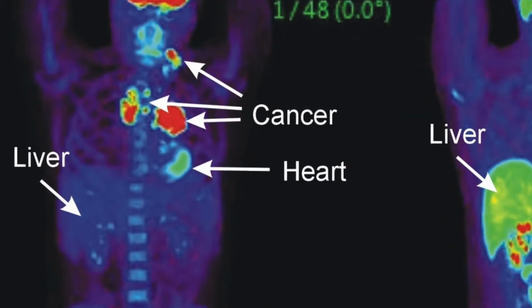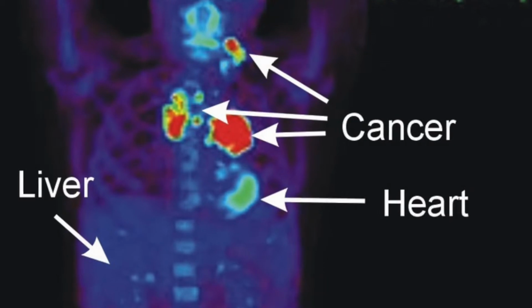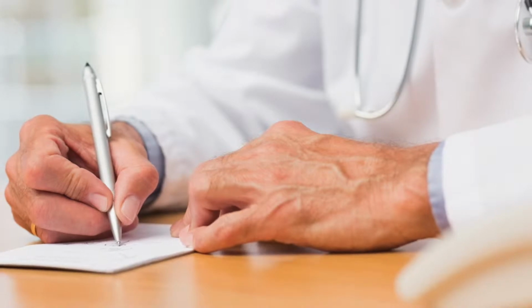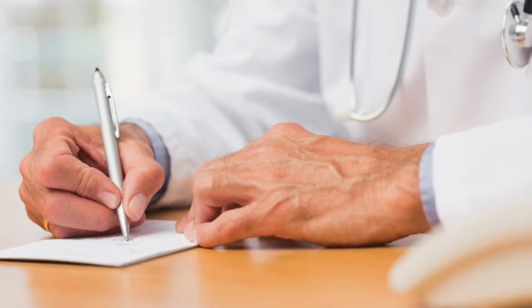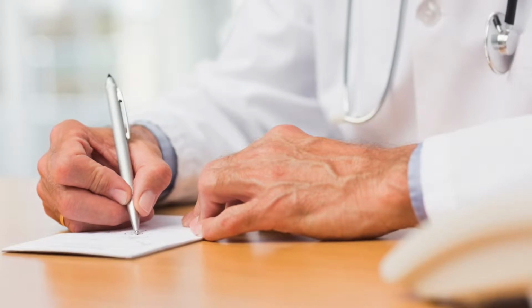Furthermore, this machine also helps in finding a specific surgical site to successfully execute an accurate surgery needed for an undefined diseased tissue or organ. Other than the brain, the PET scanner can also be used in assisting the treatment of lung cancer and to evaluate the oxygen and blood flow to the heart muscle. Overall, a PET scanner is used to detect different types of diseases and their progression through treatments and medication.